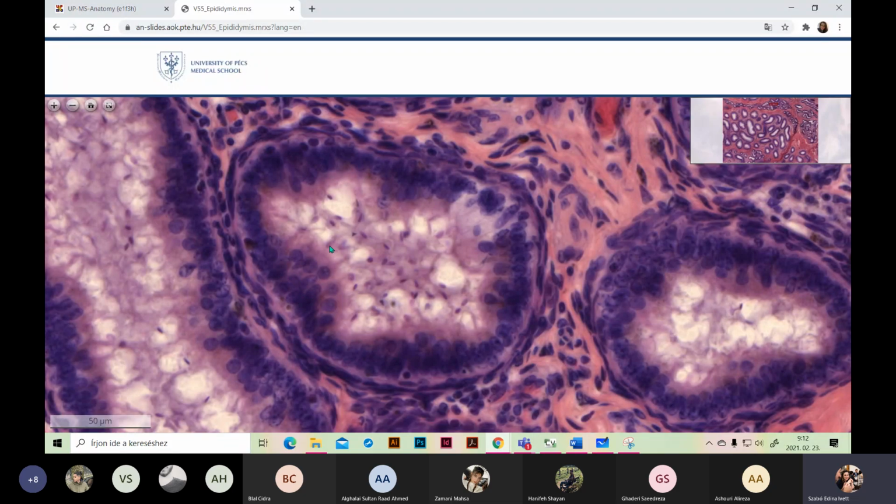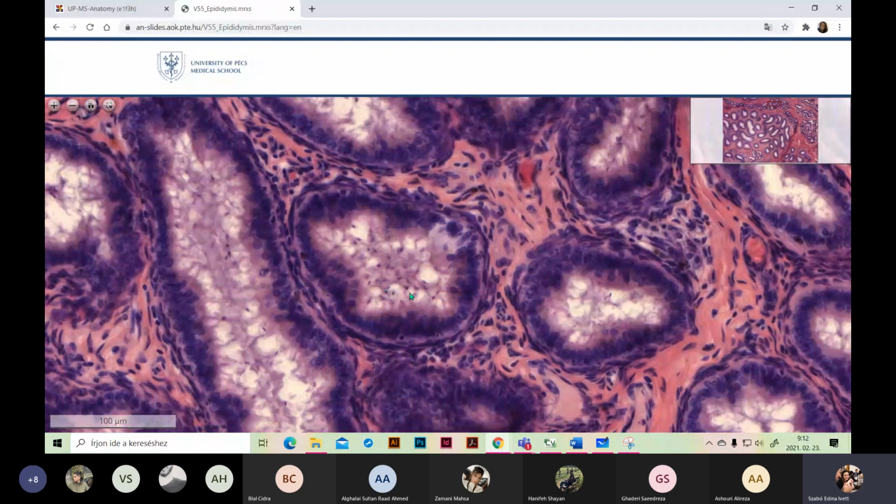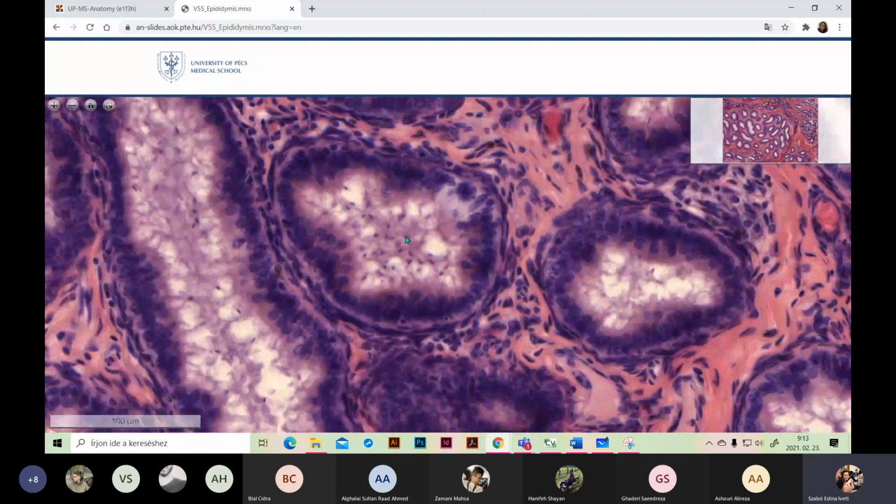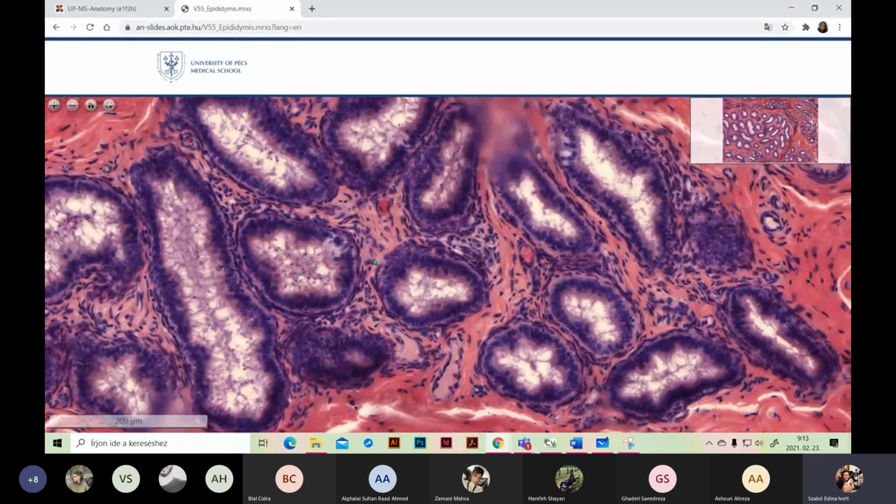And on the surface of columnar cells, we have stereocilia or we don't have stereocilia. That's why the epithelium is very irregular. This is the difference between the nice and the ugly. In case of this epithelium, we cannot see very well the reserve cells and the pseudostratified columnar epithelium. We cannot see the stereocilia on the surface very well. That's why it's an ugly one.